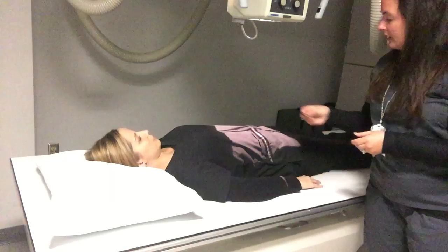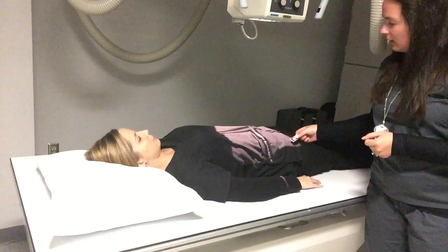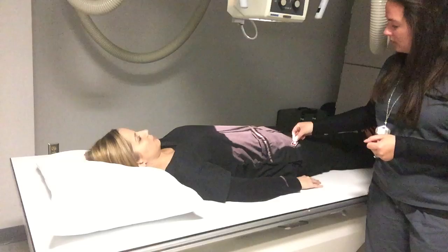I am going to mark way down in the corner where it'll be in her femoral head, rather than up where it might be in a flexure of her colon. So I'll mark down here. I'm using my right marker this time because she is turned over now. I'll have her take in a deep breath and blow it all the way out and hold it out. Stop breathing so I can expose at 120 kVp. I'm using my IDP.